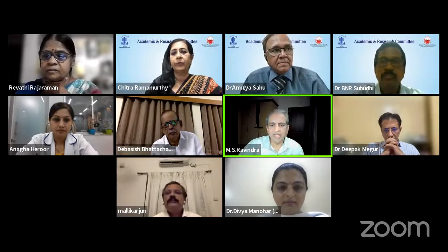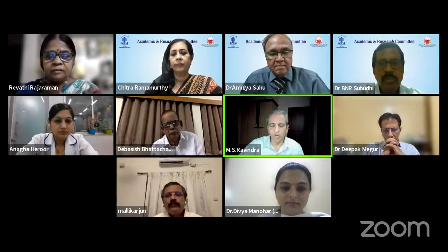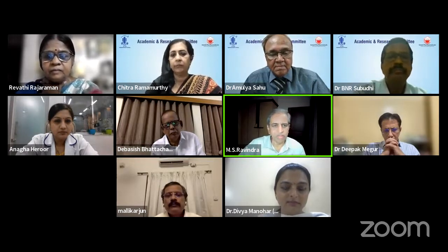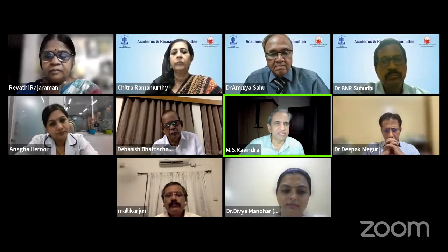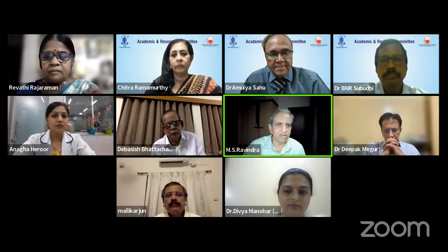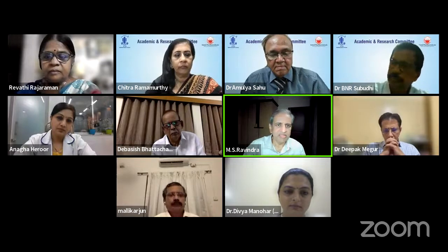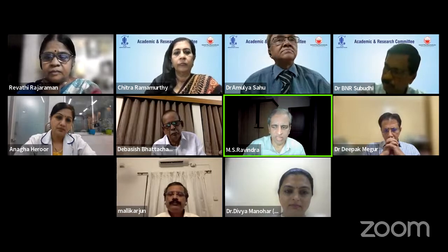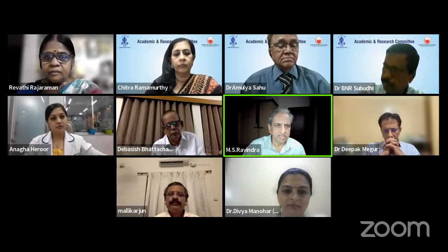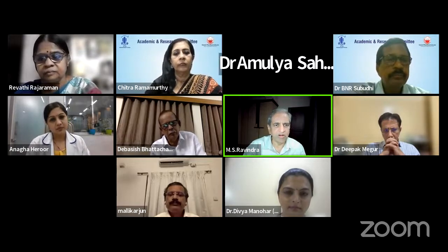Yeah, I think it depends on the basic configuration of the cornea before surgery, whether it's with the rule or against the rule. With the rule, the steep meridian is vertical. I think the best is to mark the axis just like you implant a toric lens for beginners. Mark it exactly at 180 or whatever custom you have in your hospital, and then consider this as an astigmatic cornea which can be corrected by your surgery. If it is with the rule, imagine the steep axis at 80 degrees, you start the surgery at 80 degrees. If it is at 110, you start at 110, or 105, depending upon that.